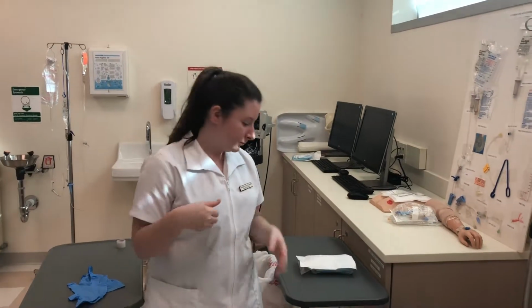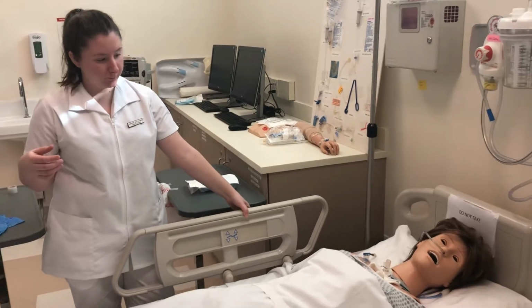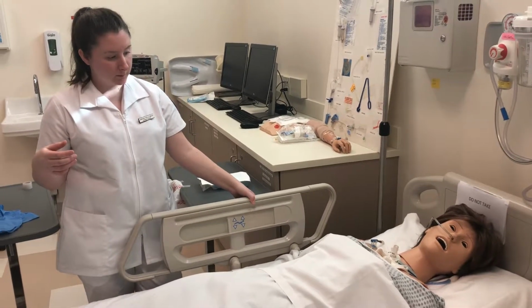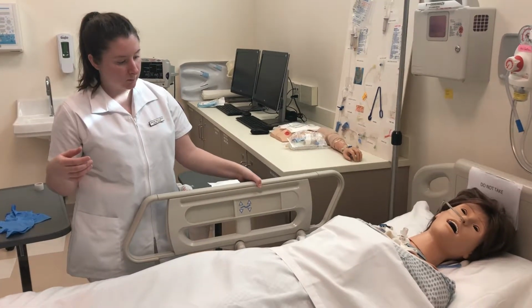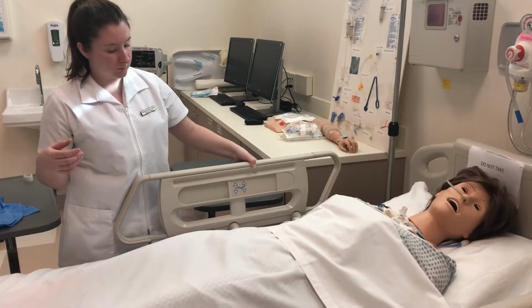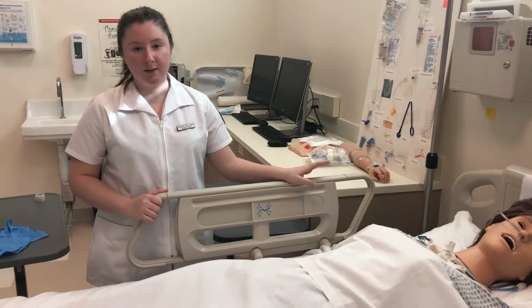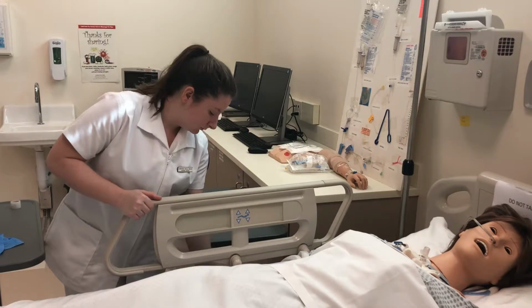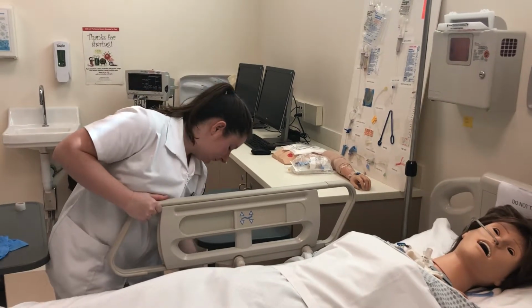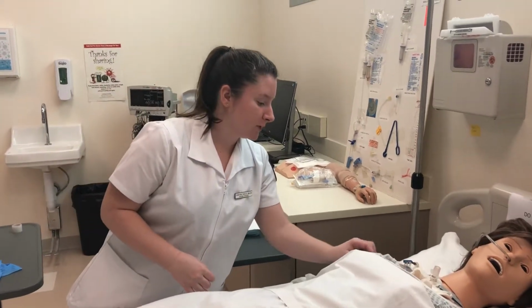So the first thing I'm going to do is bring my patient up to a working level. So my patient's at a working level, and just so I can have better access to my patient, I'm going to bring this rail down. Okay, so my rail is down, and I'm going to expose the wound, say, over here.